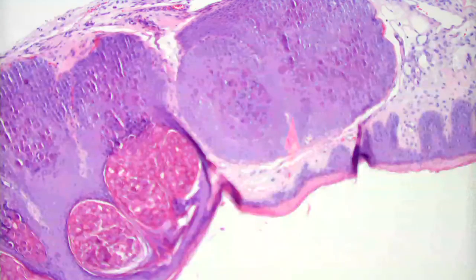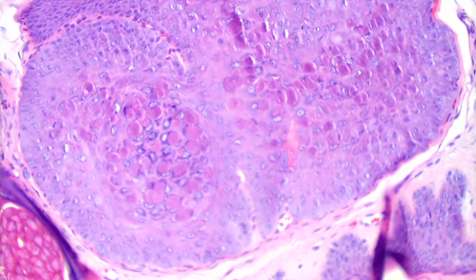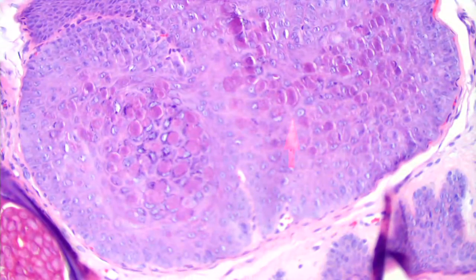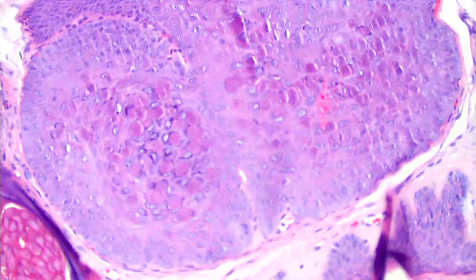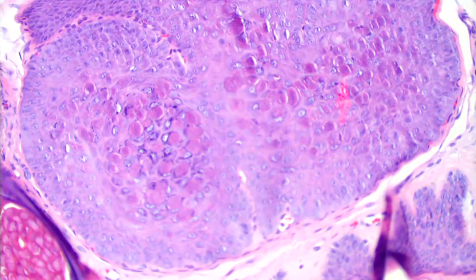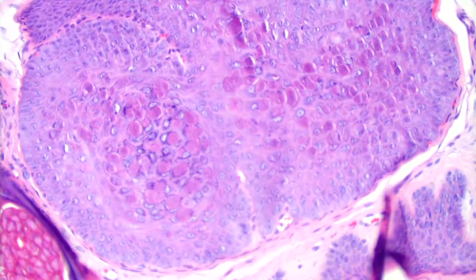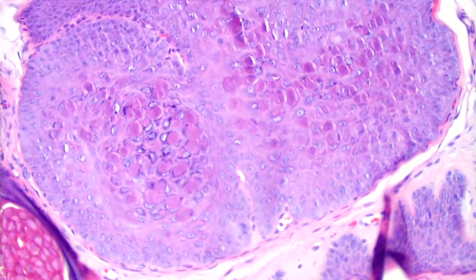What type of virus is this? What type of genome? Single-stranded or double-stranded DNA? Poxvirus is double-stranded DNA. Or you could just show a picture like this. What are the bodies? Henderson-Patterson. If this was smallpox, what are the bodies? Guarnieri, yeah, good. Was Guarnieri Argentinian, or where was he from? Italian. Could have been Argentinian.